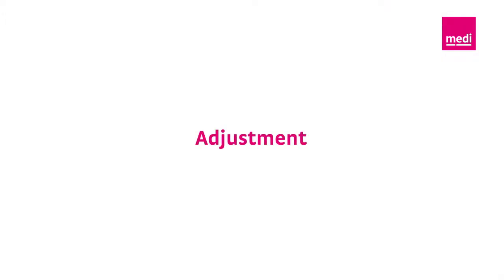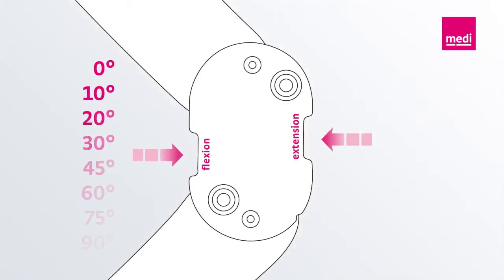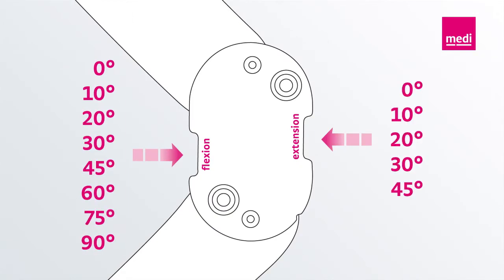The orthosis can now be adjusted. 10 degree extension wedges and 90 degree flexion wedges are pre-installed in the M4S Comfort. The wedges define the radius of movement of the knee.